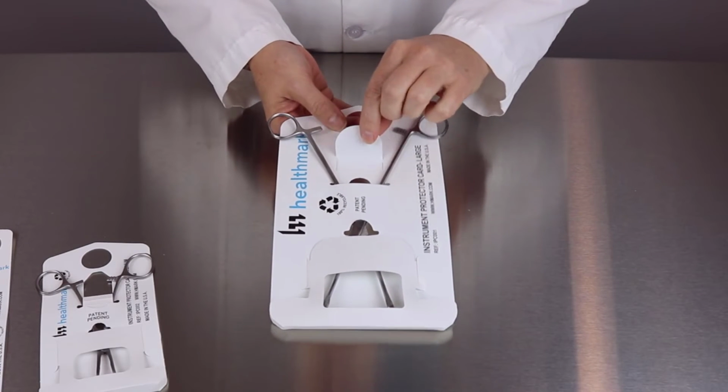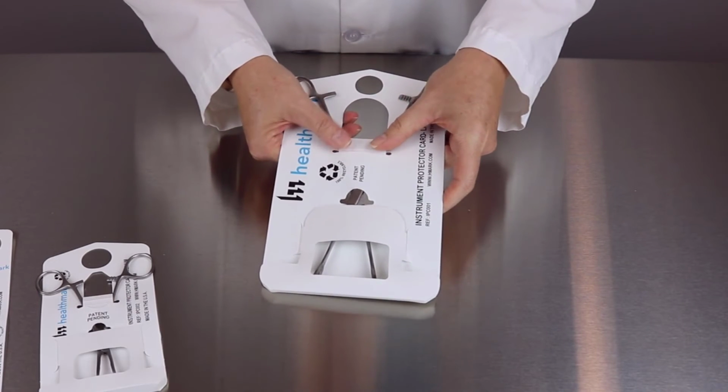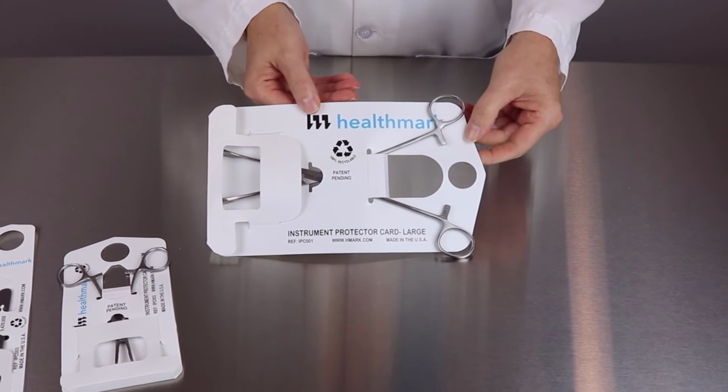You're going to take this flap, fold it over and slide it into the larger slot, and this will secure the instrument so it doesn't move. Just like that. And now you're all set to sterilize.